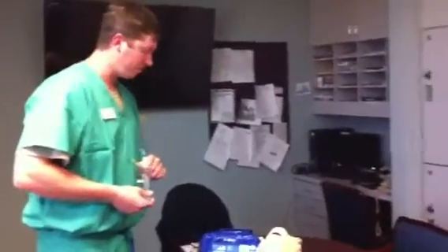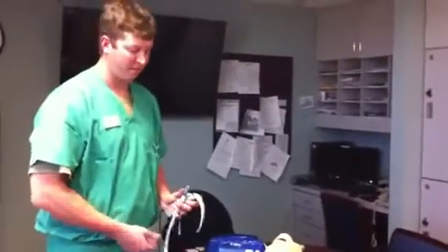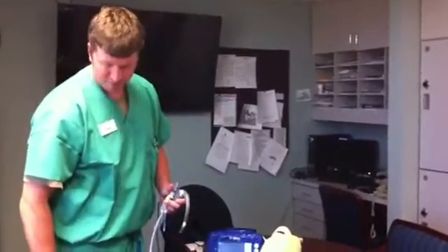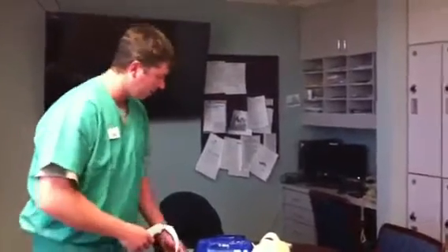Matt has the new C-Mac, which is a video laryngoscope device. It uses a CMOS sensor, which is different than a fiber optic. Matt will go ahead and talk about how to use it, how to turn it on, what the components are, and how to clean it.